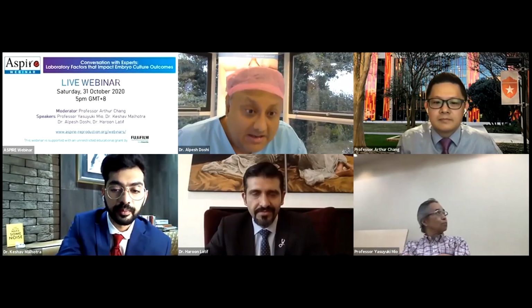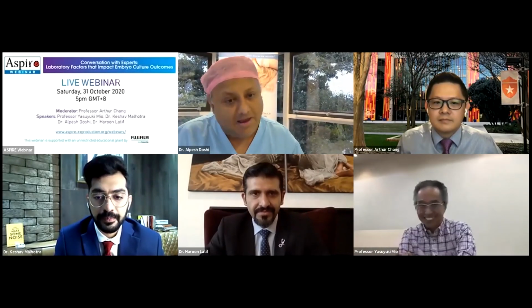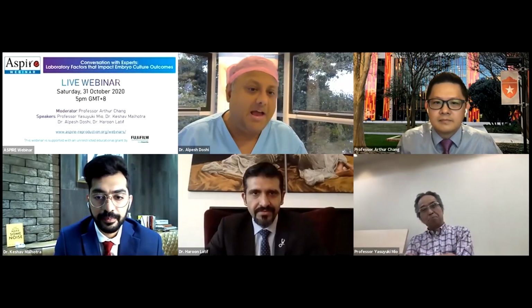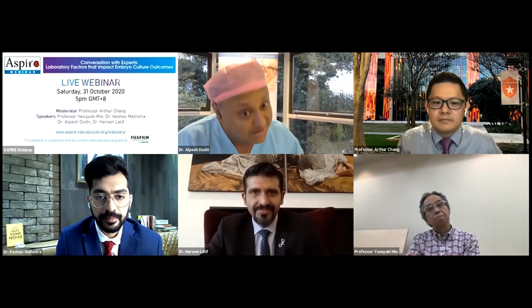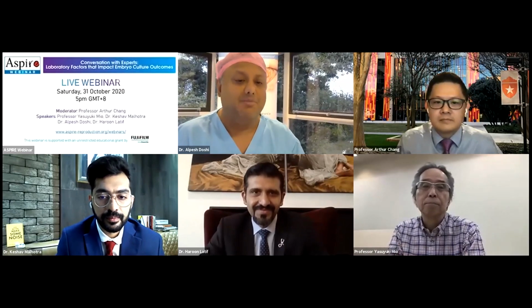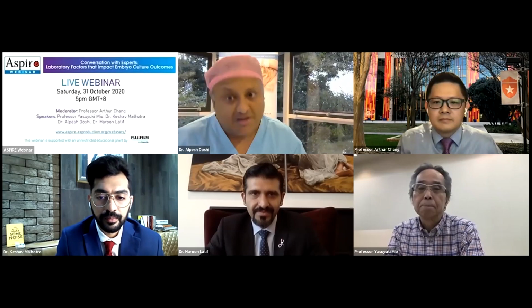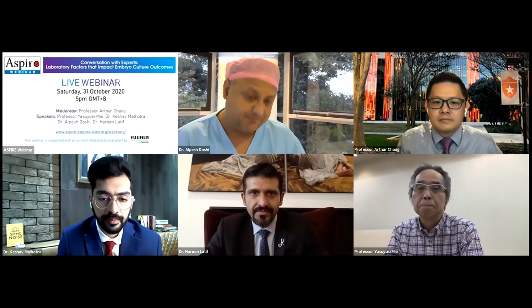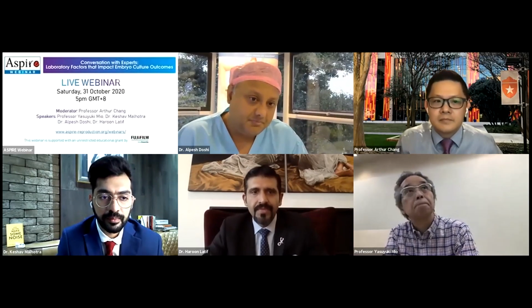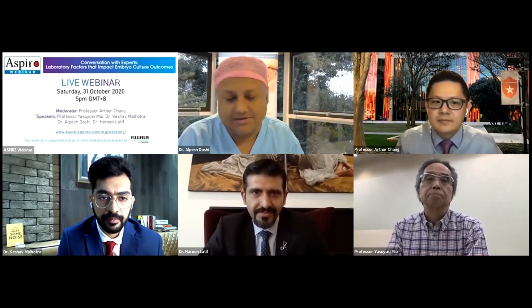Now, I appreciate that clinically, this is difficult to do because the moment you biopsy the embryo, it is collapsed and you then want to vitrify it. So what we then do is we measure that KPI at thawing. I appreciate at this point, then you have introduced a new variable, which is thawing the embryos. So that may have an impact. But the way we measure KPIs when it comes to biopsy is the percentage of embryos that re-expand post-warming. And that's an excellent point, of course, and of course, the clinical pregnancy rates, etc., etc.